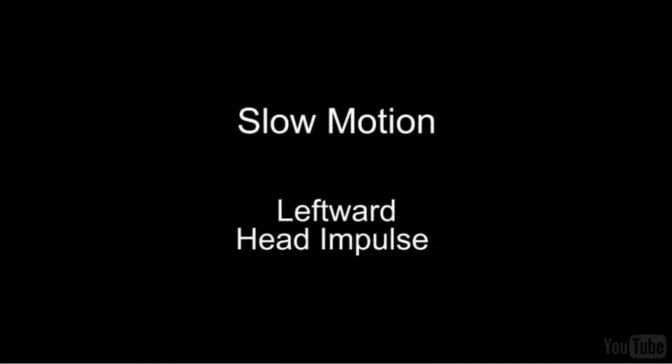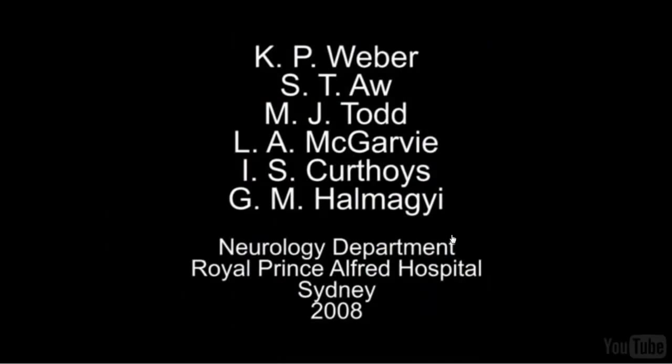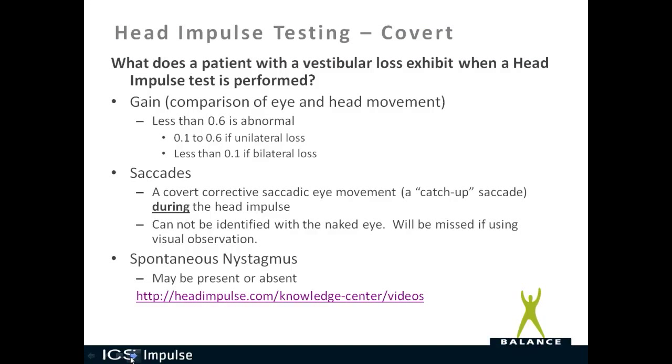Now they're going to slow down the video. Head moves. Now the rightward. Head moves, and there's the catch-up saccade. Okay, so again, you can see all those videos on headimpulse.com.